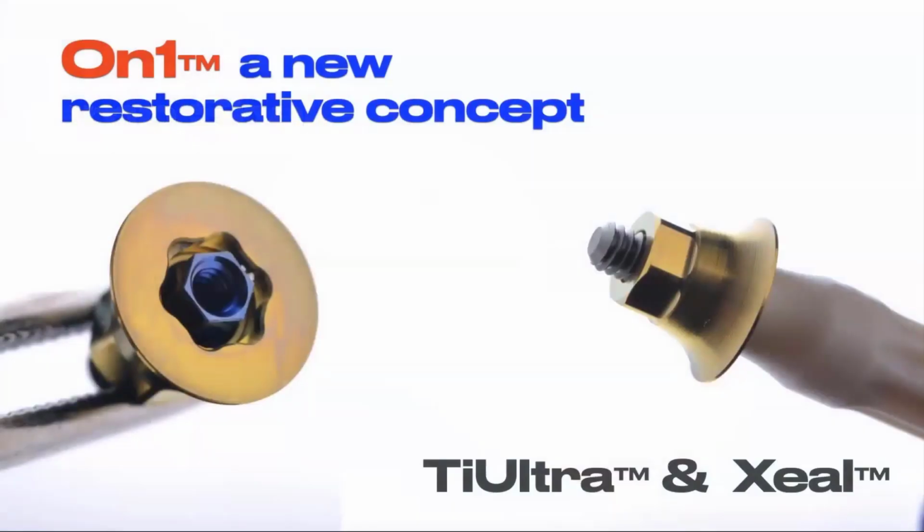And then this is an On-One abutment. This is a platform that I believe in a lot, where we place this into the implant, torque it down, and it never comes out. It seals off the implant abutment connection on the day of surgery and really allows everything to be stabilized.